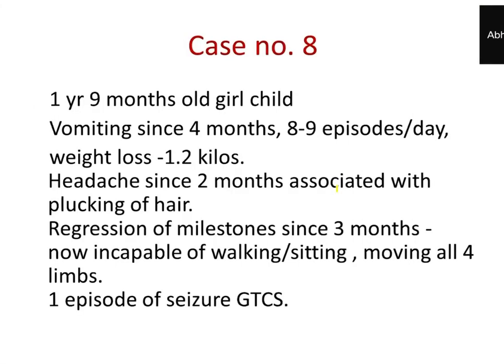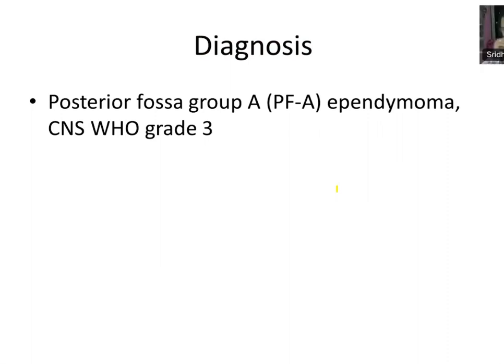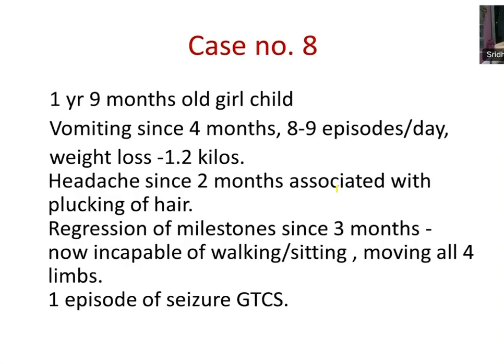Yeah, just one thing, a little bit of input which comes from the clinical history. Like, sir, we keep discussing 5 years of age. It's a reasonably decent partitioning between PFA and PFB a lot of the time. So what he wanted to say is that most of the time, less than 5 or 6 years, they turn out to be PFA type only. But application of these IHC will be more useful in the 5 to 10-year-old, where you can get PFA type also, or B type also. You can use these markers. Okay. Pooja, can we go to the next case?